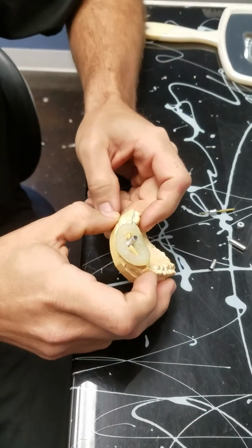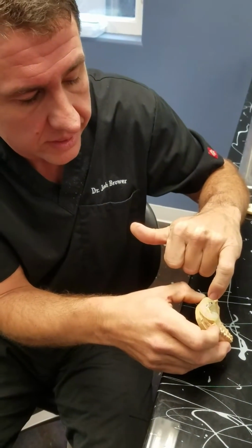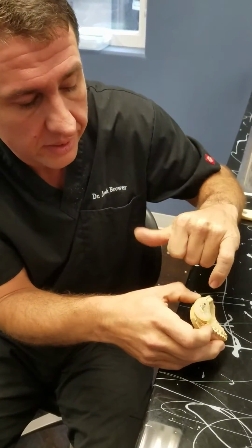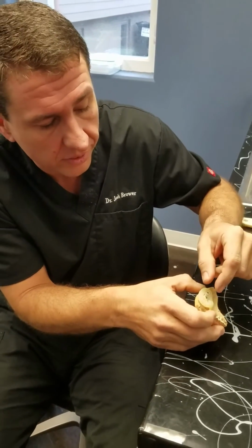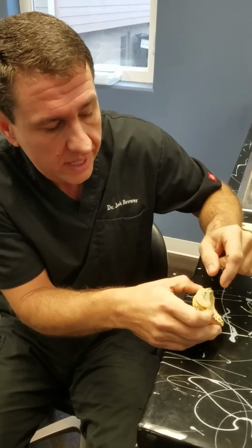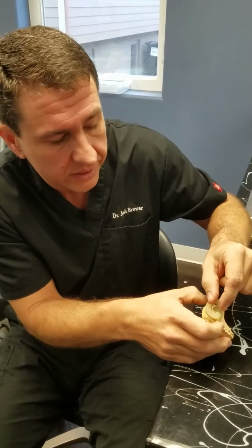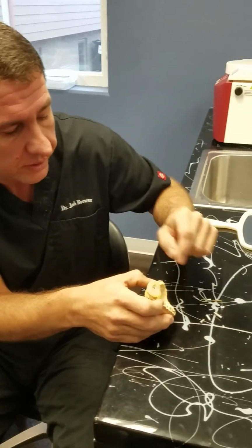And then the interlock drill with the implant in it is going to slowly slide down the inside of that channel very tightly, keeping it on track all the way to the bottom. So you're going to bury the handpiece all the way to the top, and when you've done that, you know that the implant is within a millimeter of the tissue below.